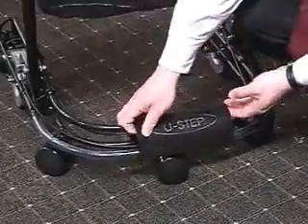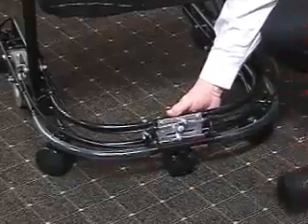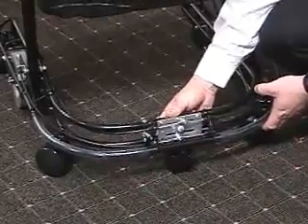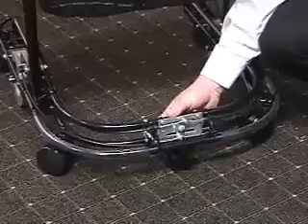The U-Step also has a front-loaded spring wheel. This allows the unit to easily ride over bumps and cracks such as molding strips and cracks in the sidewalk.